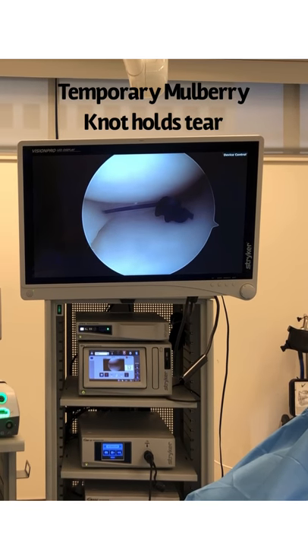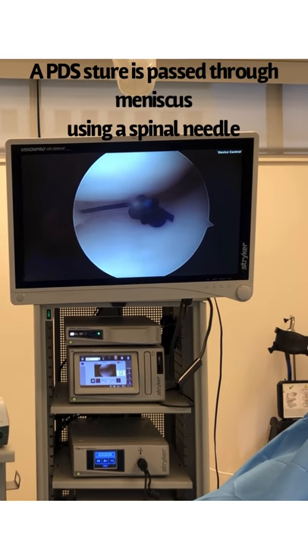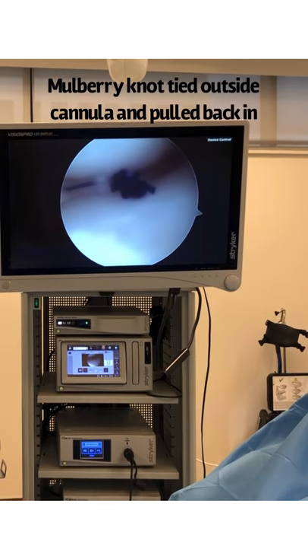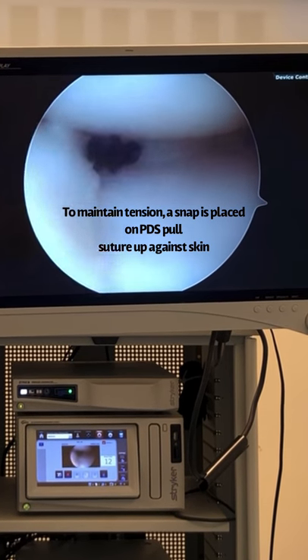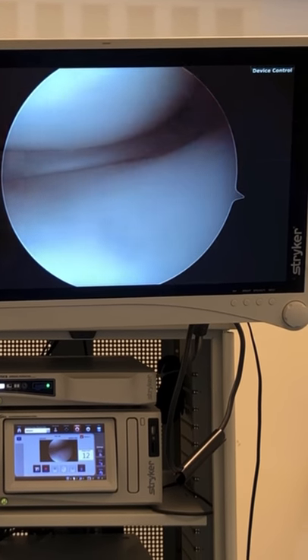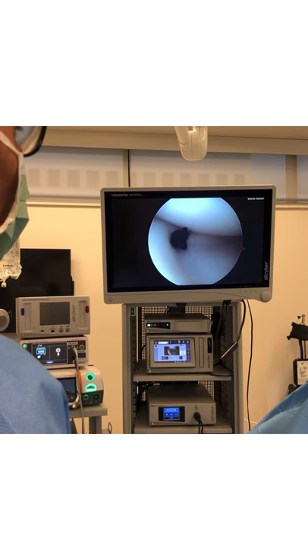So I pass the PDS using a spinal needle, pass the PDS, tie my mulberry knot, and then I go like this — see — and now my mulberry knot will hold the meniscus in place as I repair it. Now I'm going to be able to put my suture there, there, there, and then once my sutures are in, I can remove the mulberry knot.